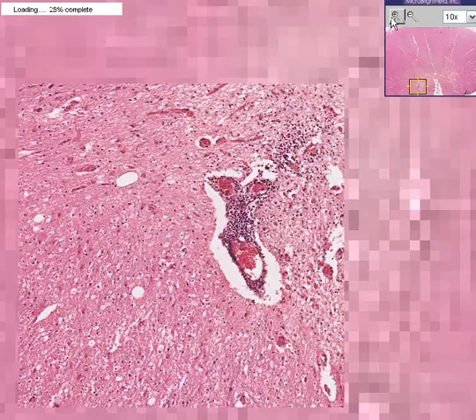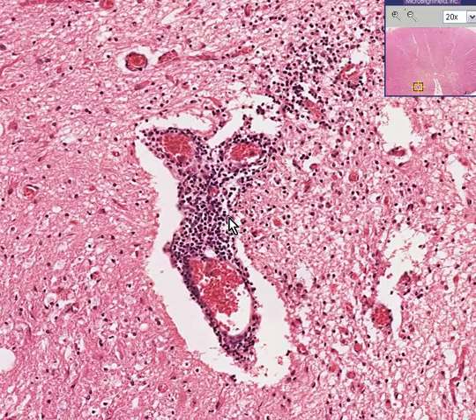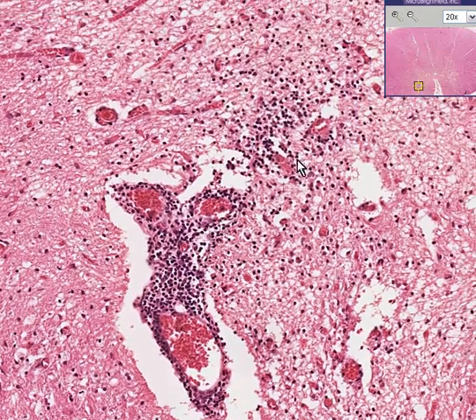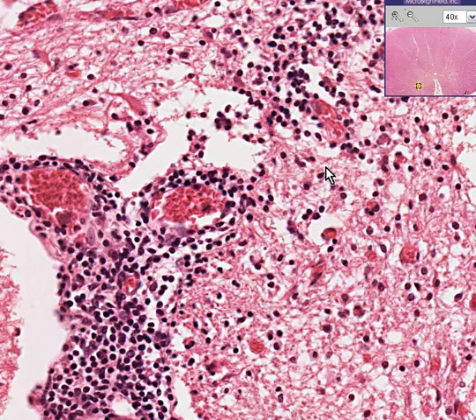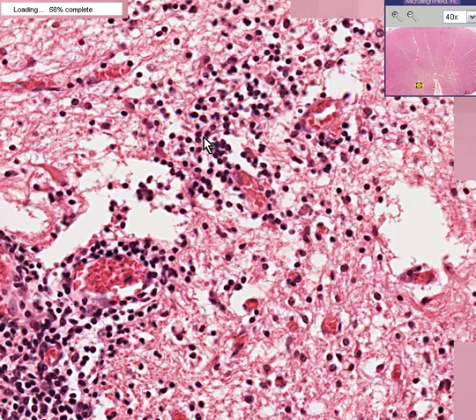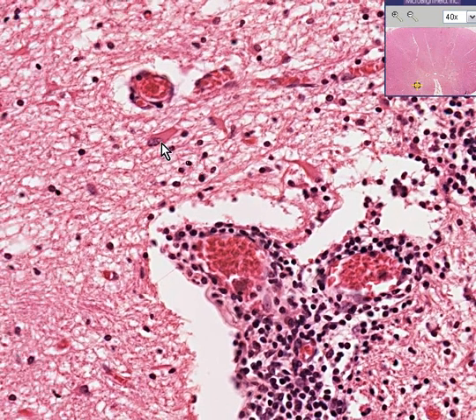Well, you can see that there are some inflammatory changes. They are chiefly perivascular, but they also involve the gray matter of the spinal cord itself. There's an inflammatory process going on here. And although chiefly you can see a reaction of glial cells as part of this inflammatory process, please note that there are occasional neurons, like here and here, which are being involved also.